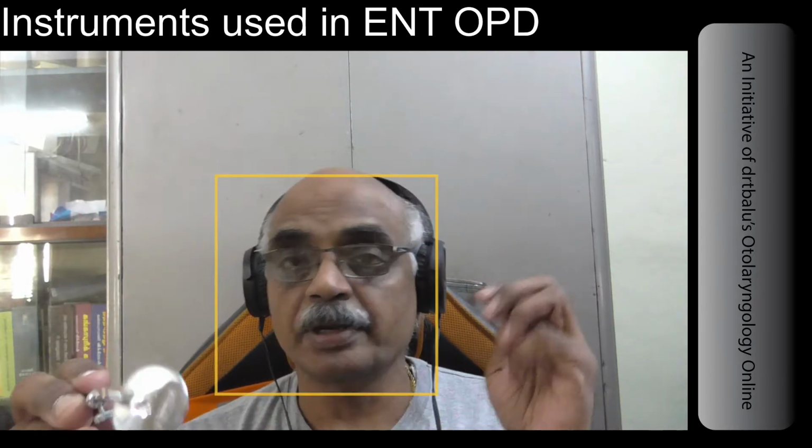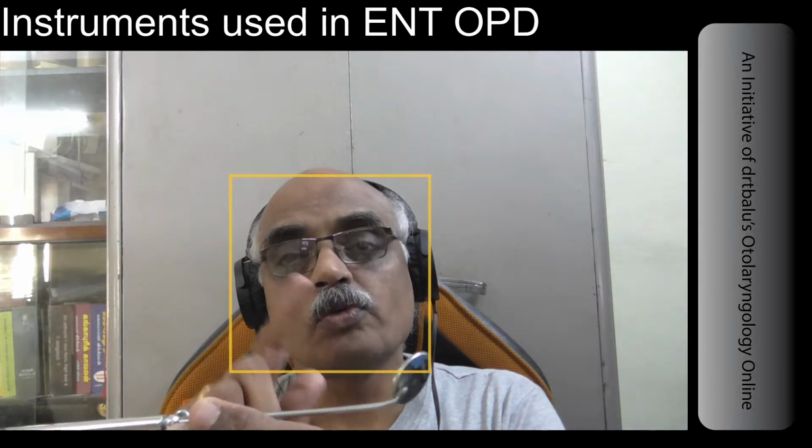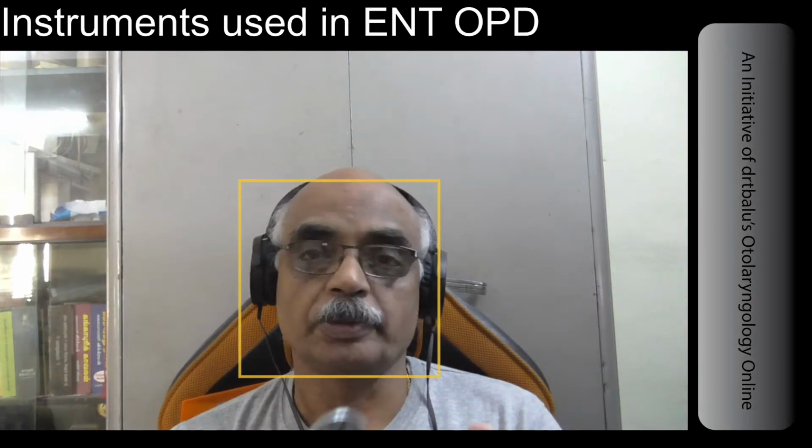The main problem with these mirrors happens to be they have a tendency to get fogged. So when you are examining, fogging is also likely to occur. So how can you prevent fogging from occurring? You need to warm the mirror. How can you warm the mirror? You can use a spirit lamp or warm water to warm this mirror.